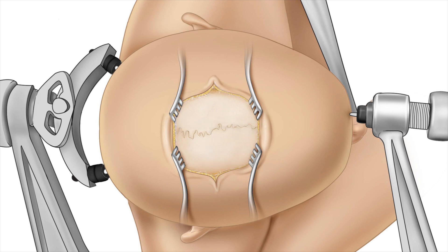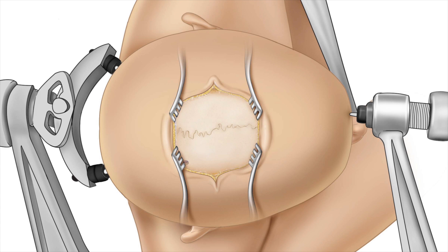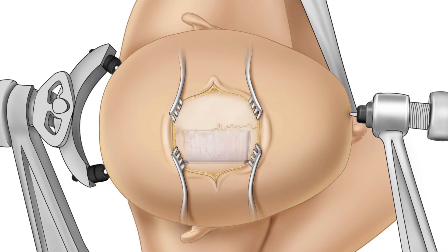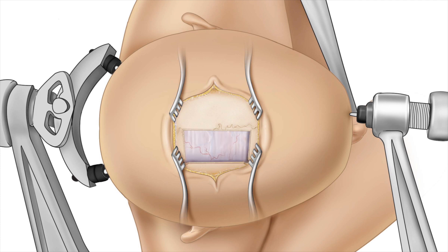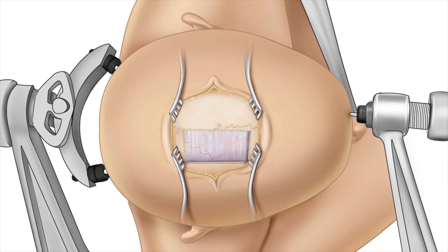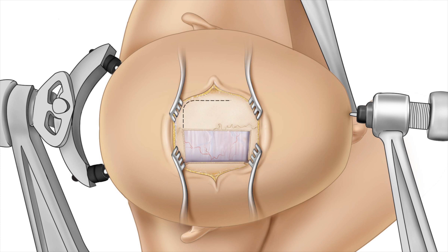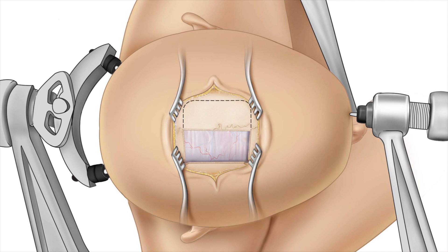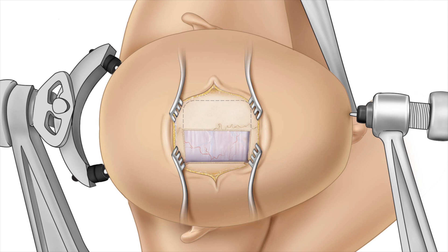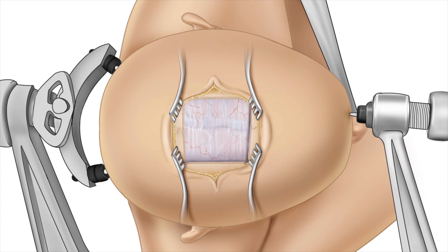The dotted lines outline the initial part of our craniotomy, or opening in the skull. I prefer performing a two-part craniotomy in order to visualize and avoid damage to the underlying superior sagittal sinus. The initial part of the craniotomy has been performed in a rectangular configuration just off of the midline. The superior sagittal sinus is dissected off of the overlying skull, and the second portion of the craniotomy is performed.